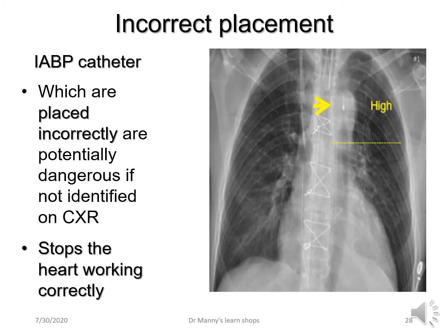If the catheter is placed too high, look, the radio-opaque tip is very, very high in the aortic arch, knob, knuckle, which could obstruct blood flow to the subclavian or carotid arteries. But this is a good X-ray. You can see the radio-opaque tip, and you can see the helium in the actual balloon, like a long sausage, going all the way down the descending aorta. Incorrect placement. It needs to be pulled back.